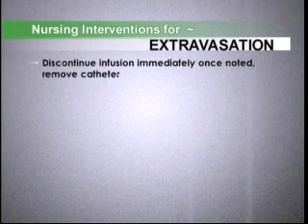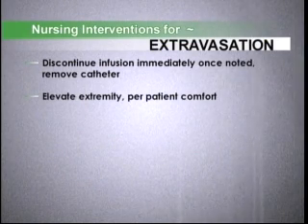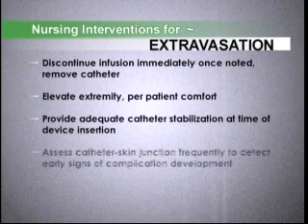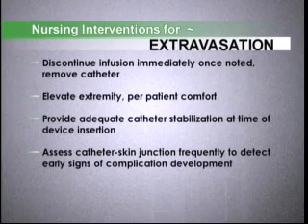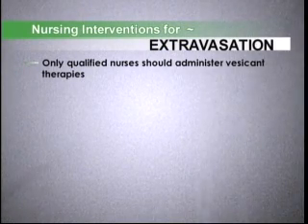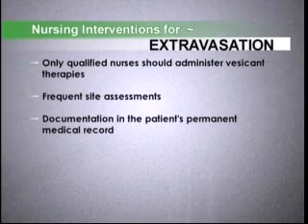Extravasation. Discontinue infusion immediately once noted and remove catheter. Elevate extremity per patient comfort. Provide adequate catheter stabilization at the time of device insertion. Assess catheter skin junction frequently to detect early signs of complication development. Only qualified nurses should administer vesicant therapies. Perform frequent site assessments and documentation in the patient's permanent medical record.